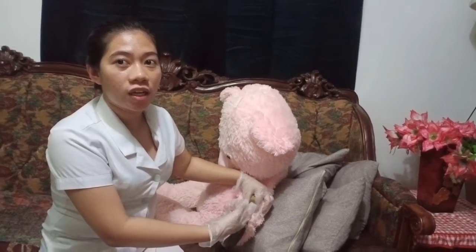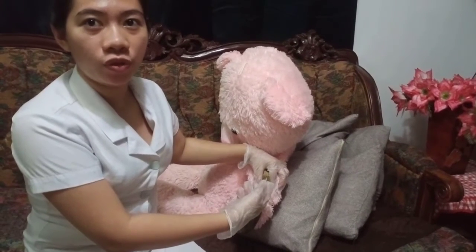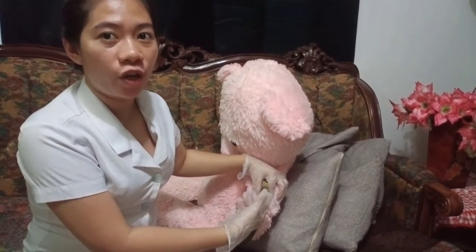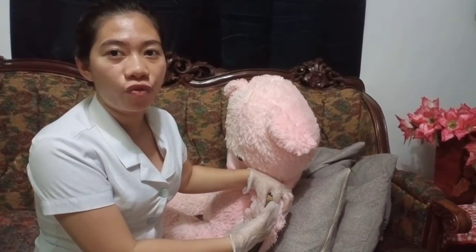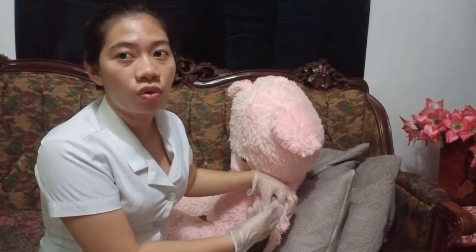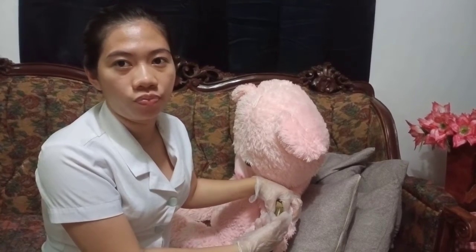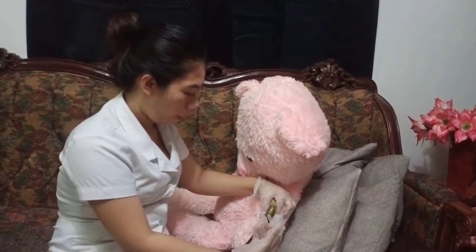Then, hold the barrel of the syringe steadily with your non-dominant hand and aspirate by pulling back the plunger with your dominant hand. Then, if blood appears in the syringe, withdraw the needle and use another needle. If blood does not appear, inject the medication steadily and slowly while holding the syringe steadily. So, ma'am, I will start injecting now, okay? Okay.